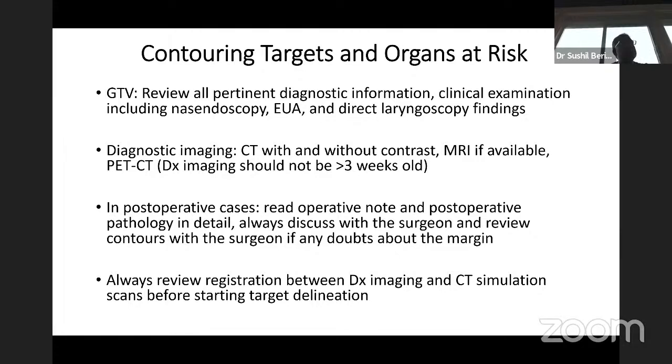When they looked at pathological studies comparing the size of the GTV with the surgical specimen, it usually corresponds to about 40% of the maximal SUV as your GTV. So it's important when you are defining your GTV on the PET scan, you window it appropriately. In post-operative cases, it's important to read the operative note and post-operative pathology because that's the hardest to define. And if you're using different diagnostic imaging, you need to make sure your registration is correct. If the registration is not correct, then your GTV and CTV can look whatever you want them to look.